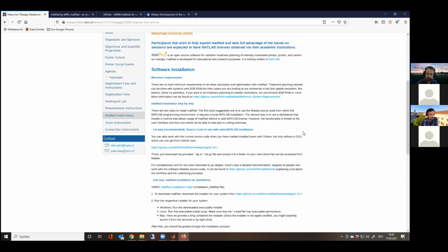But on the other hand, I'm also extremely thankful if you tell us that it doesn't work, because that helps us to improve it. And then maybe for the next school or the next masterclass or the next course that we give or that someone else gives, we can remove these problems, or we are made aware of them. So I'm really sorry if something doesn't work for you, or something crashes, or some plan will not go, or the installation will not even run through, or the optimizer will crash, or whatsoever. Things like that happen.